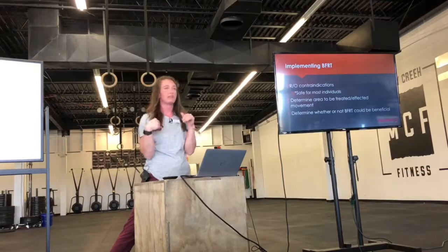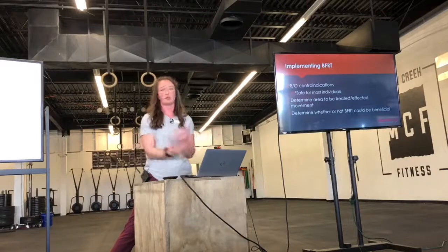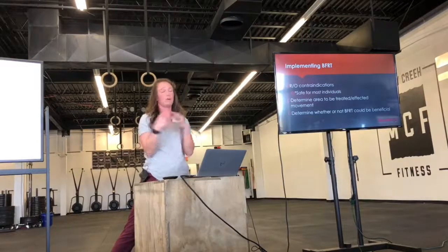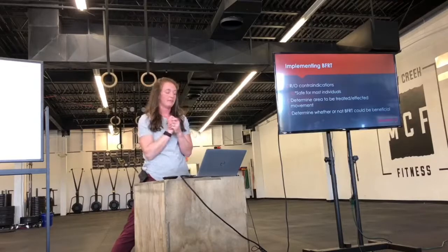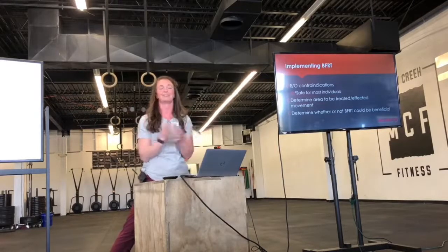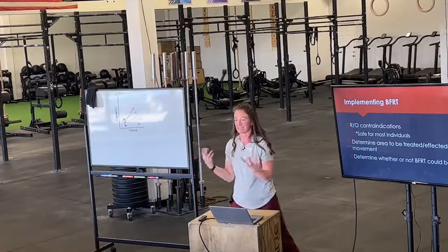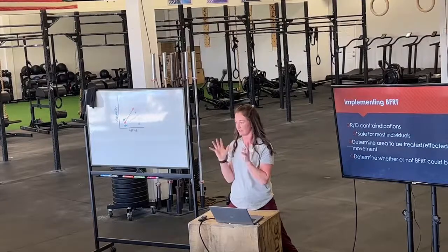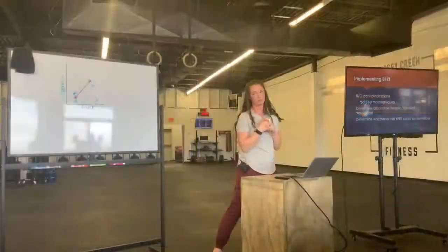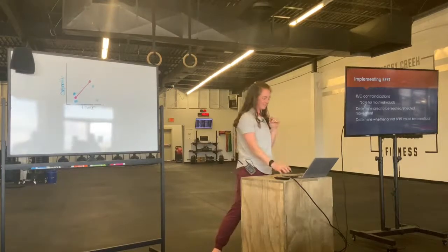But whenever you come to us, okay, if we're thinking that this is something that we might want to add into your plan of care, again, it's a tool. It's not the end-all, be-all. It's not going to fix everything. It's just a tool that we can add in if we think it's beneficial. We're going to roll out those contraindications. We may want to clear you with your medical doctor first. And then we're going to determine which area needs to be treated, which movement you are limited with. Is it your bicep curl, which we don't really do a lot of in here? Is it your triple extension in your pull, right? Is it squatting? Is it hinging? What type of movement patterns are affected because of your strength limitation? And then we're going to discuss whether or not it is beneficial for your goals. So, does anybody have any questions before we get started? Okay, Brooklyn?